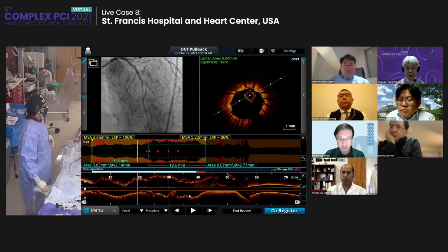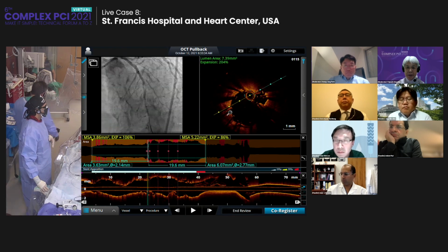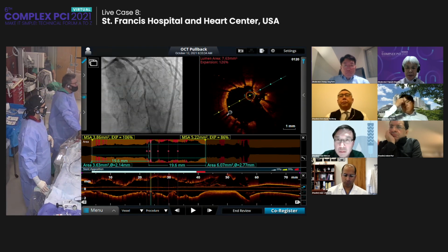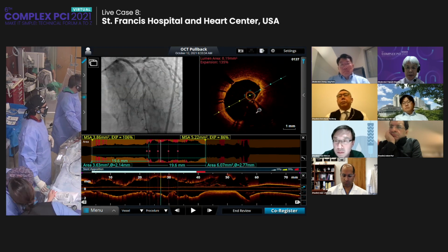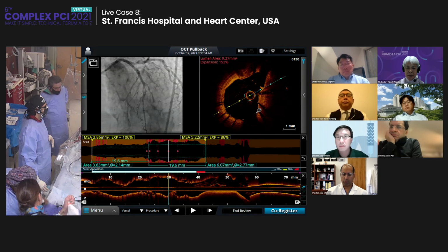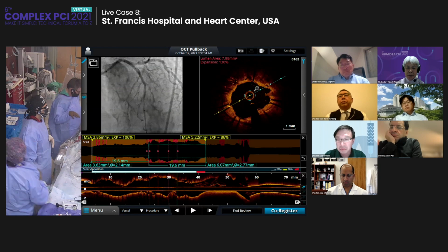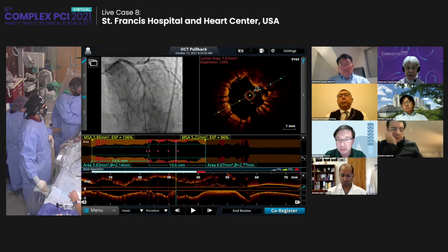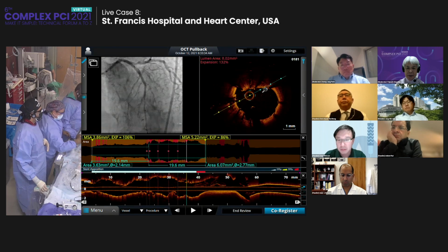See, the stent is actually very concentric. Here's an example of where the fracture, you'll have automatic or predefined malapposition. You can see a fracture here where it's pushing the wall away. Another segment where there's a big fracture and then some malapposition. Another fracture here. But these are very, very good areas.